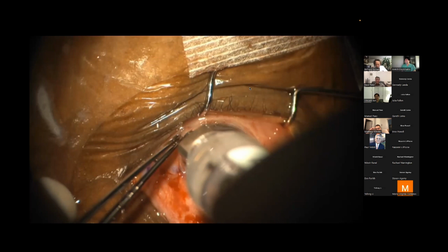Well, no. I saw you marked the conjunctiva nicely, so I'm sure you're going to put it back. So when we go back to put the glaucoma implant on, we can have an easy time. That's why we do it.